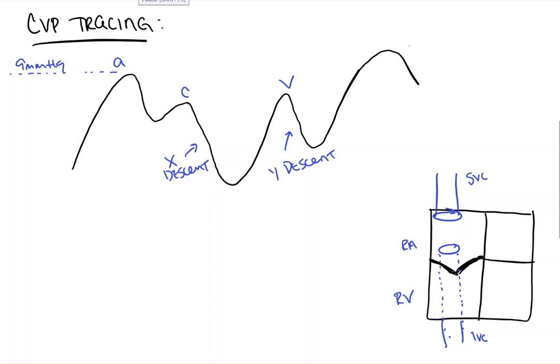Hi everyone, on this video from Count Backwards from 10, we're going to take a look at the CVP tracing. There's a lot of great YouTube videos out there, so now I'm going to take my shot at it for us in anesthesia.